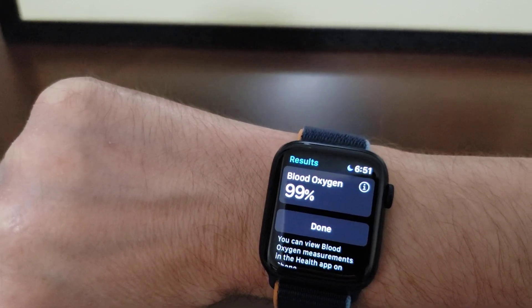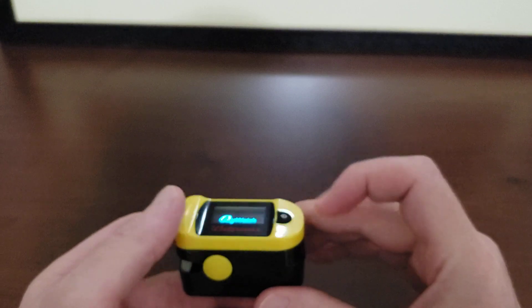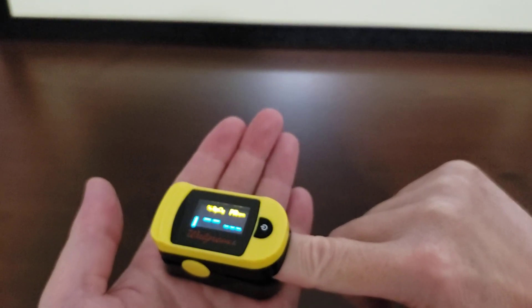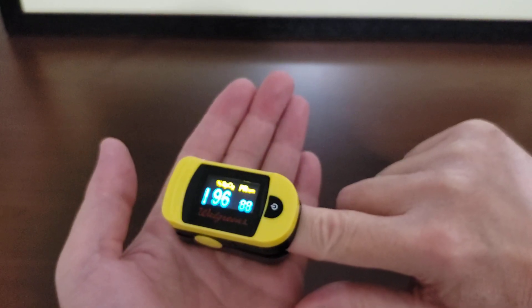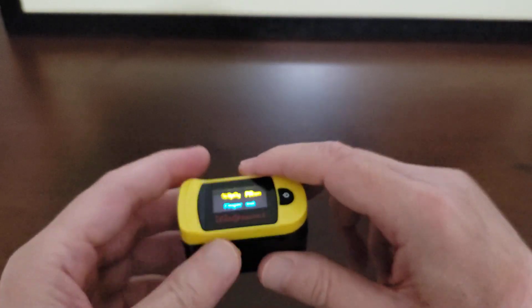Pulse ox: 99% on the Apple Watch. Now let's see what the fingertip reader has to say — putting the finger in. 96%. So in this case we have a three percent difference.